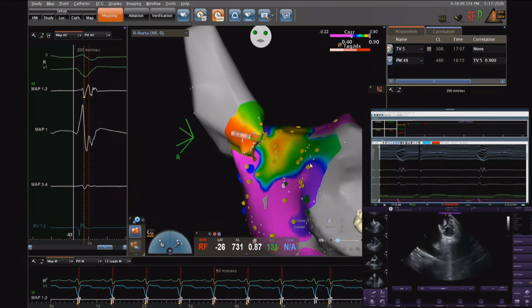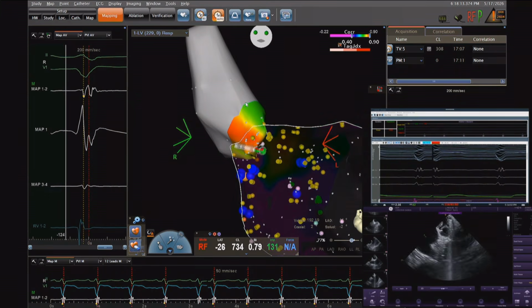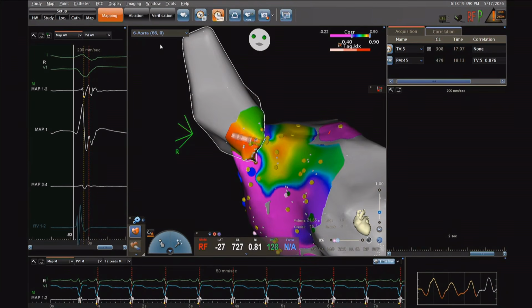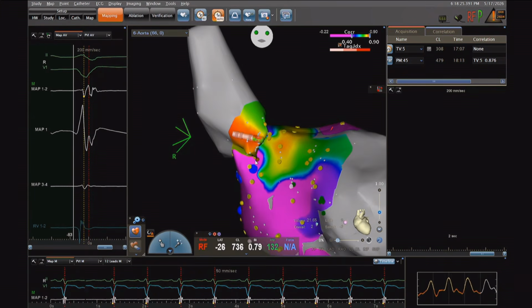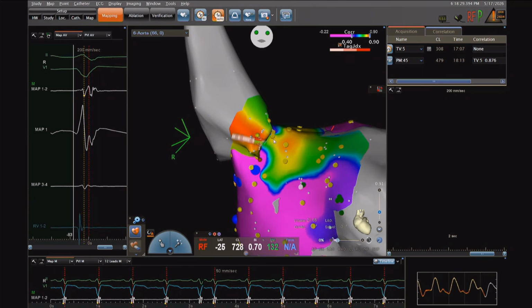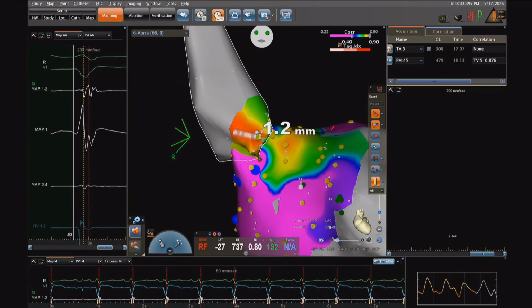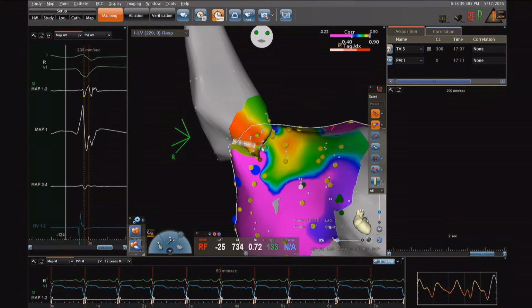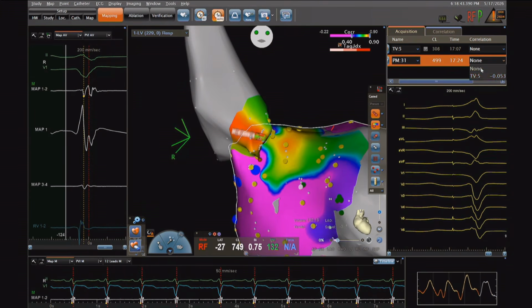And if I may, Joseph, you see the percentage of correlation you have here is 90%. And on the opposite side, in the ventricle, which is very close by, because of the blue dots that you have below here, the distance is something like 15 millimeters, not more. Maybe we can measure between here and here. The distance is 15. So over 15 millimeters from this side, you go from 90 to 40% of correlation. So we have a big gradient.